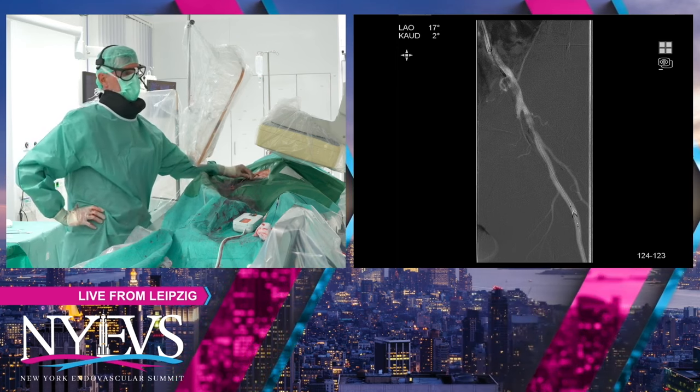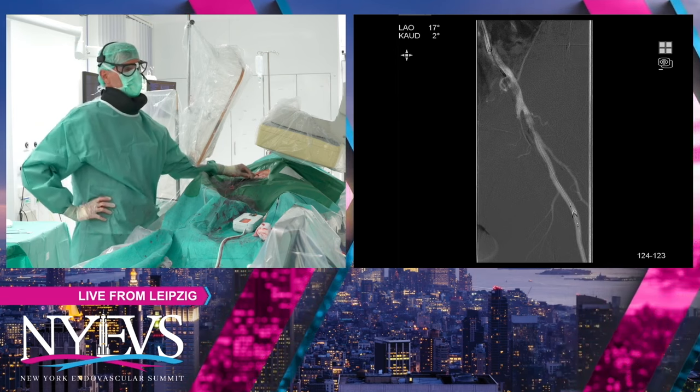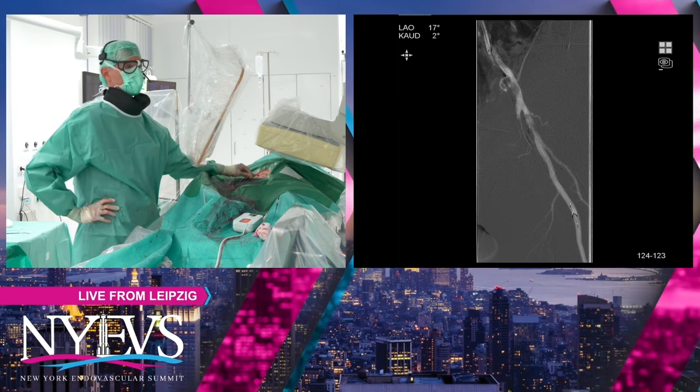Yeah, it could be, again, IVL and eccentric plaques. The proximal one, maybe not that effective. And the distal one could rather be effective.